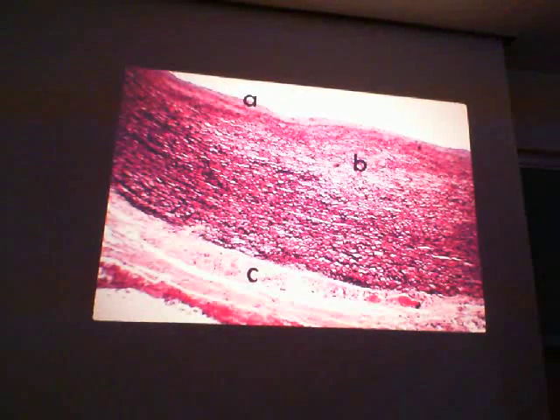Okay, what organ do we see here? Elastic artery. And that layer right there is what? Tunica intima, and that makes this the tunica media. Then out here we have tunica adventitia. And how about this structure we see right there? Collectively, that would be called what? Vasa vasorum. And how about these little squiggly lines we see right there? What are those? Elastic fibers. Hence the name elastic artery.